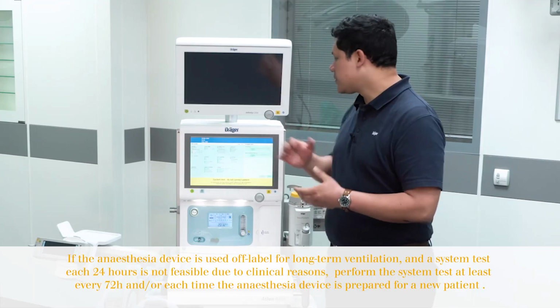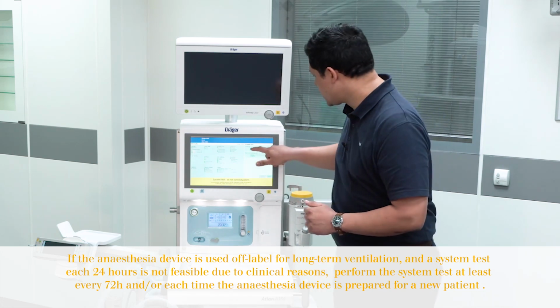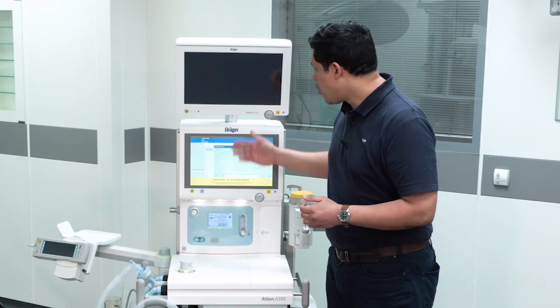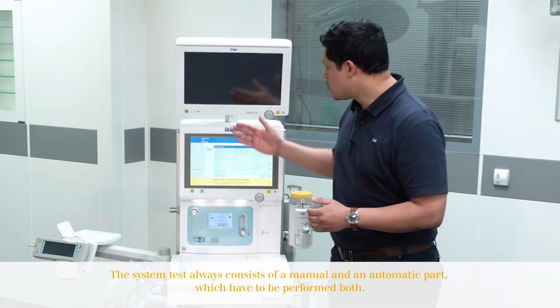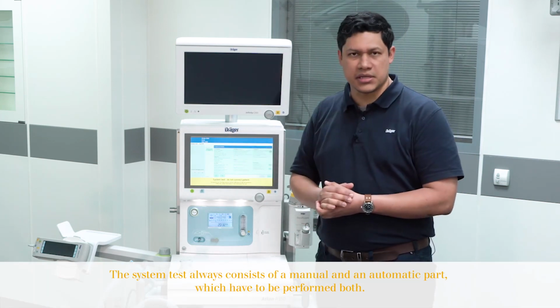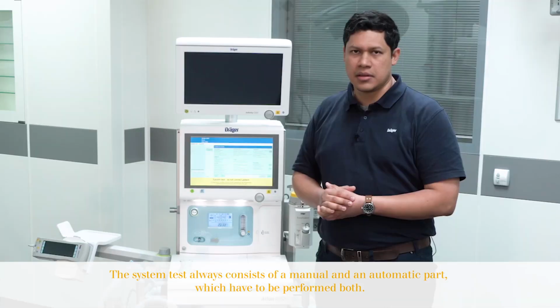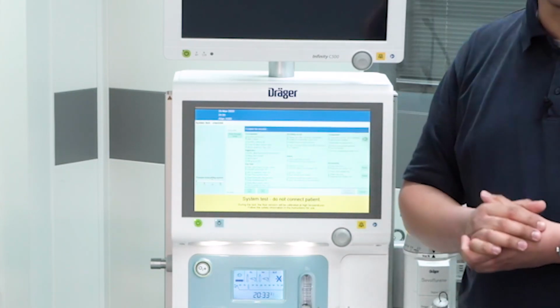The complete system test should be performed every 24 hours. You just press on system test and you have displayed all the complete checklist you have to go through. Once you have verified all the items in the list, you just press the check. If you need to get familiarized with the procedure, you press on the walkthrough mode.